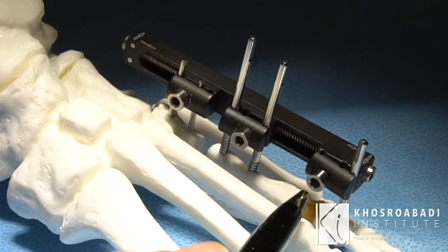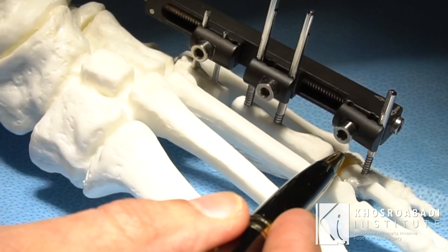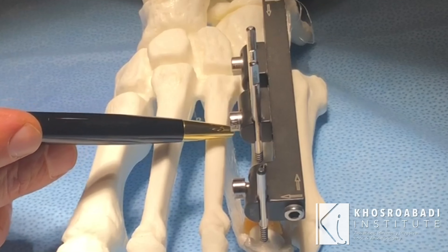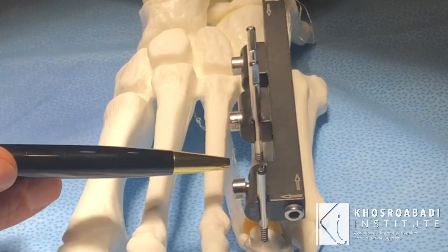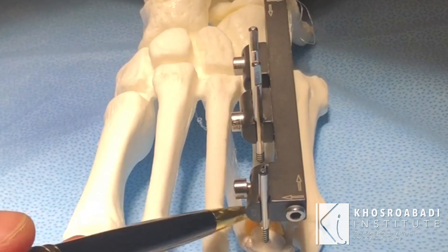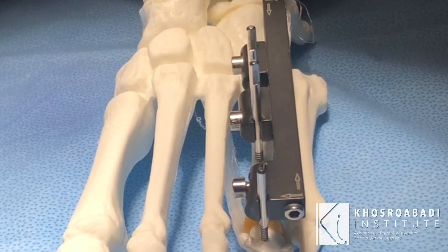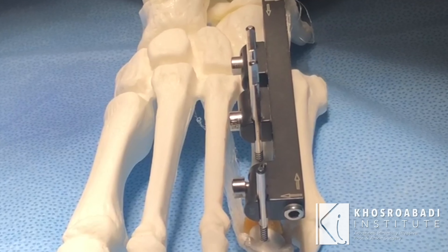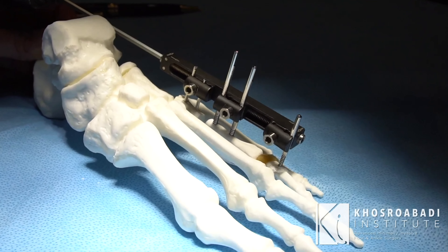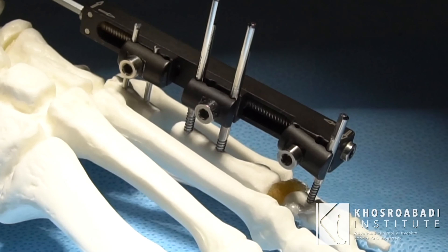Most of the complications with metatarsal lengthening are solved with this new construct and technique. As we lengthen the bone, the toe is kept with the construct. If you pay attention to this area, the joint stays very intact and will not in any way get jammed.